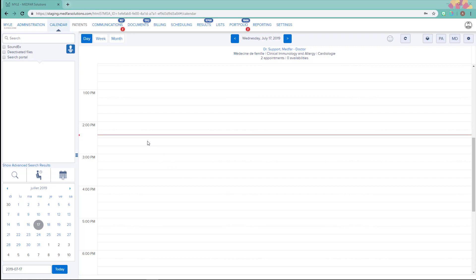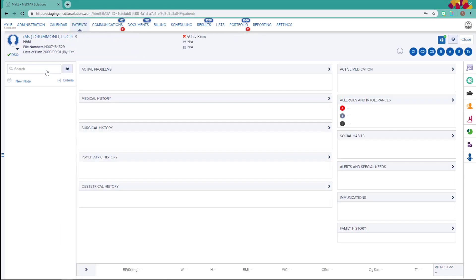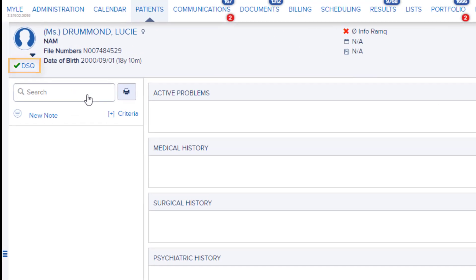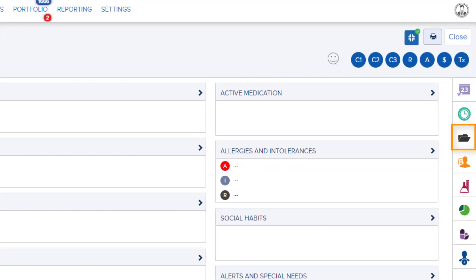DSQ results are accessible from the patient file. Once the file is open, make sure that it's synced to the DSQ. A green checkmark in the top left corner will inform you that the sync has already been completed. Then, go to the scanned documents section.